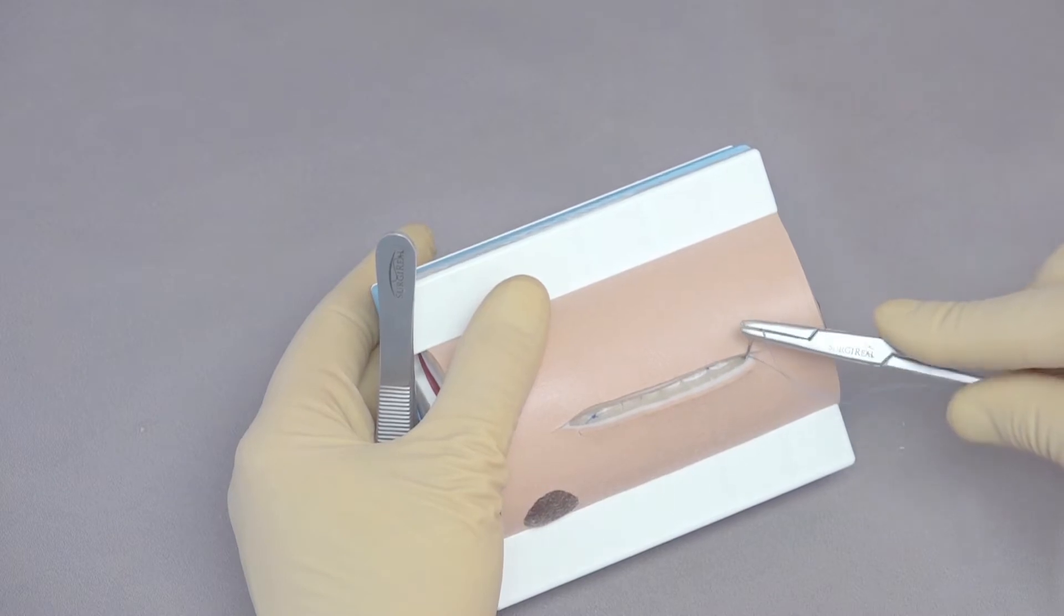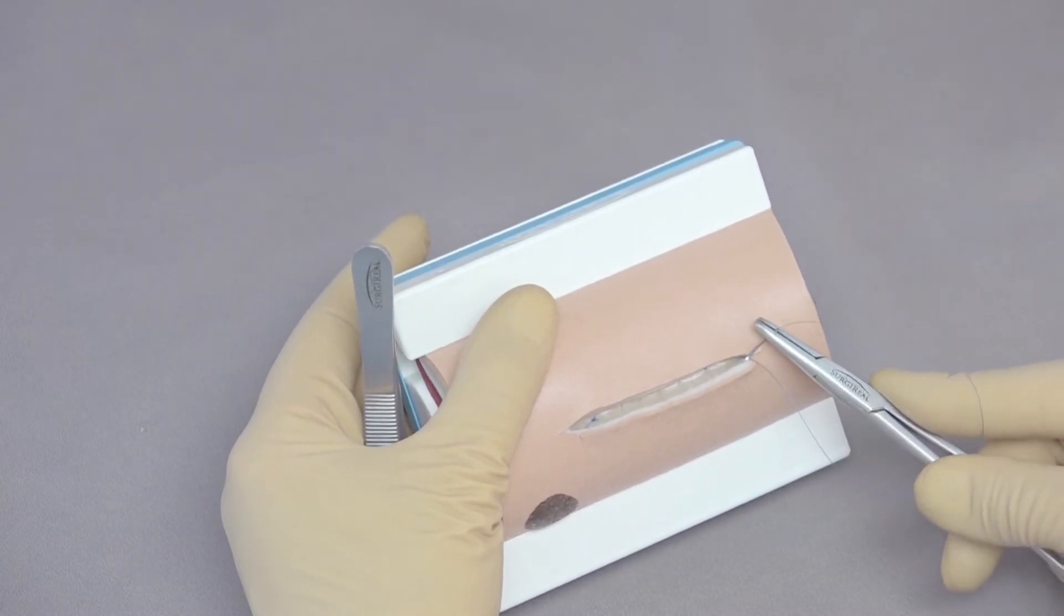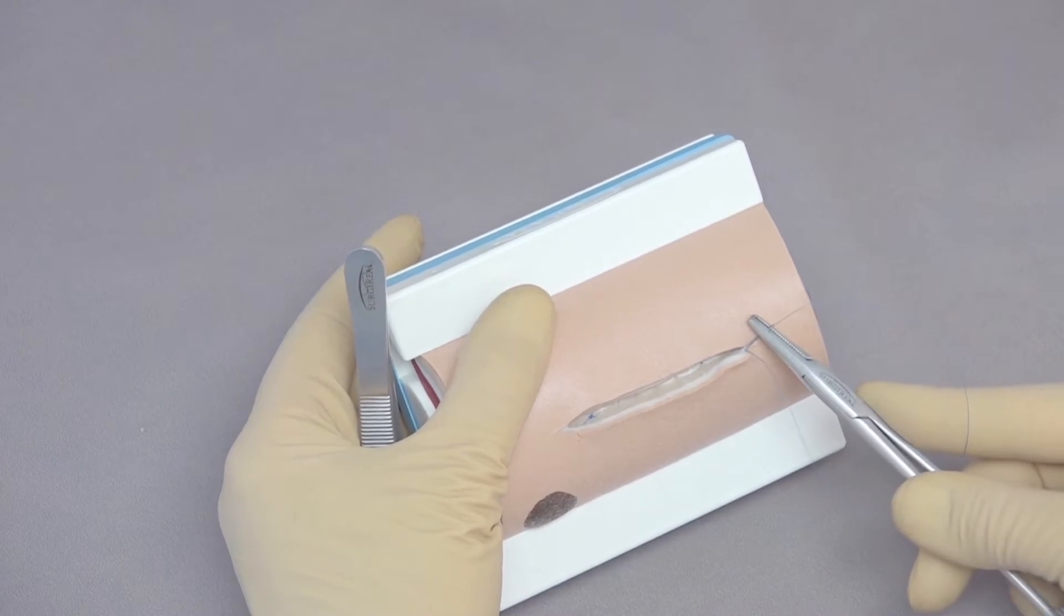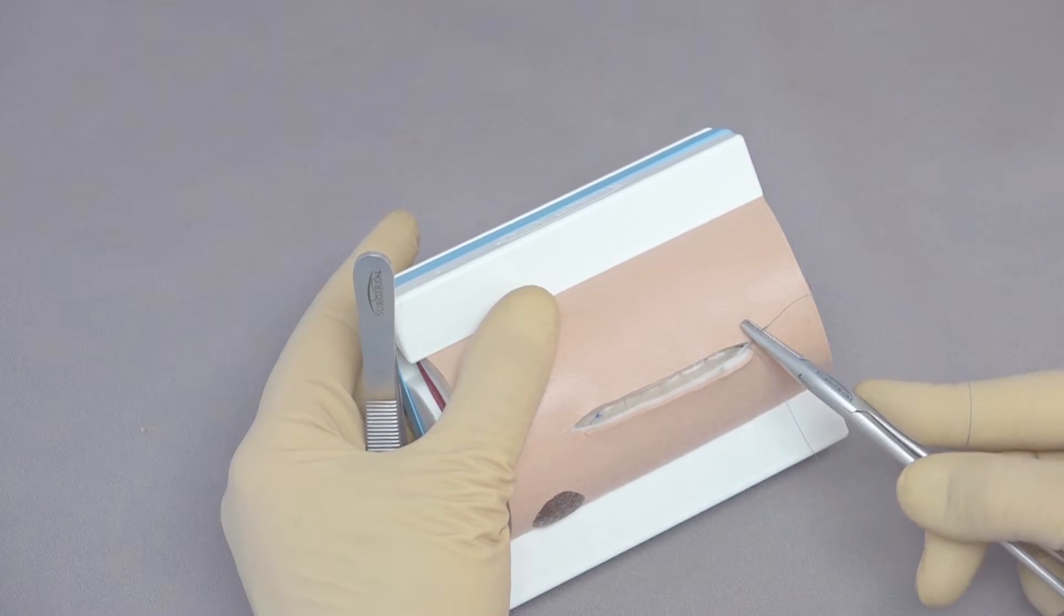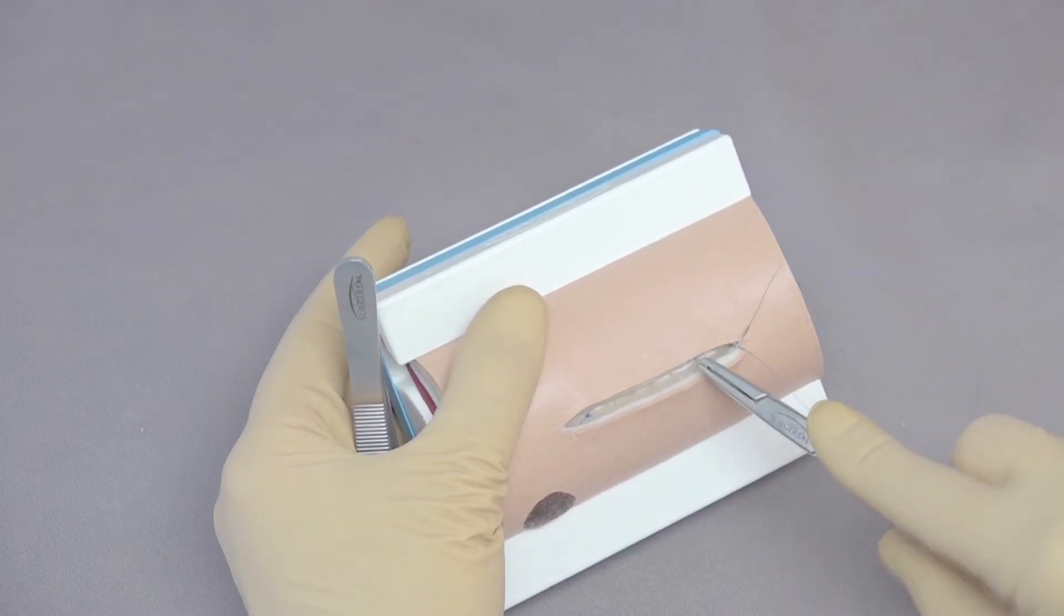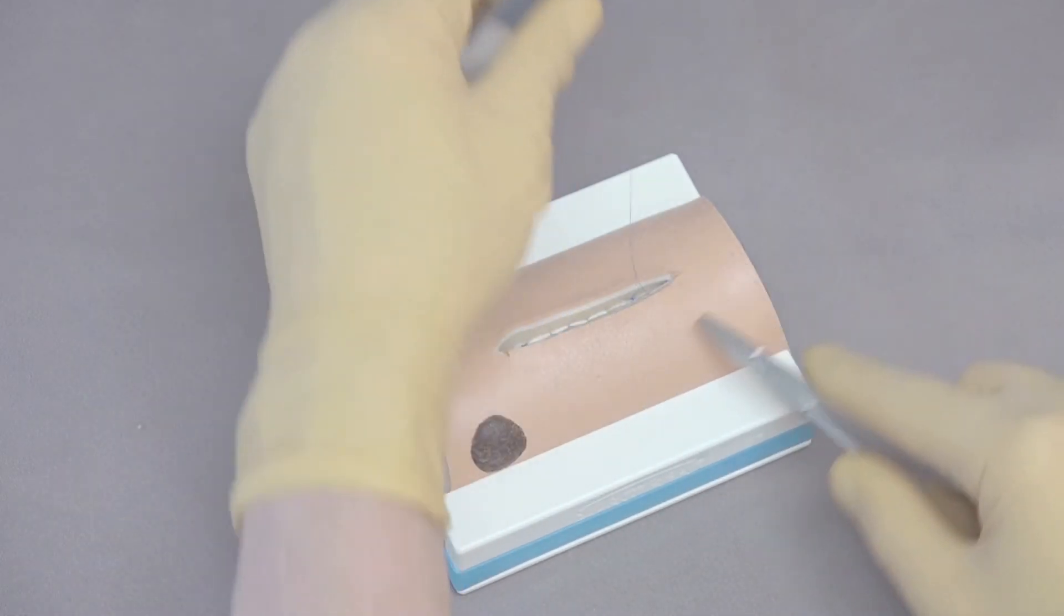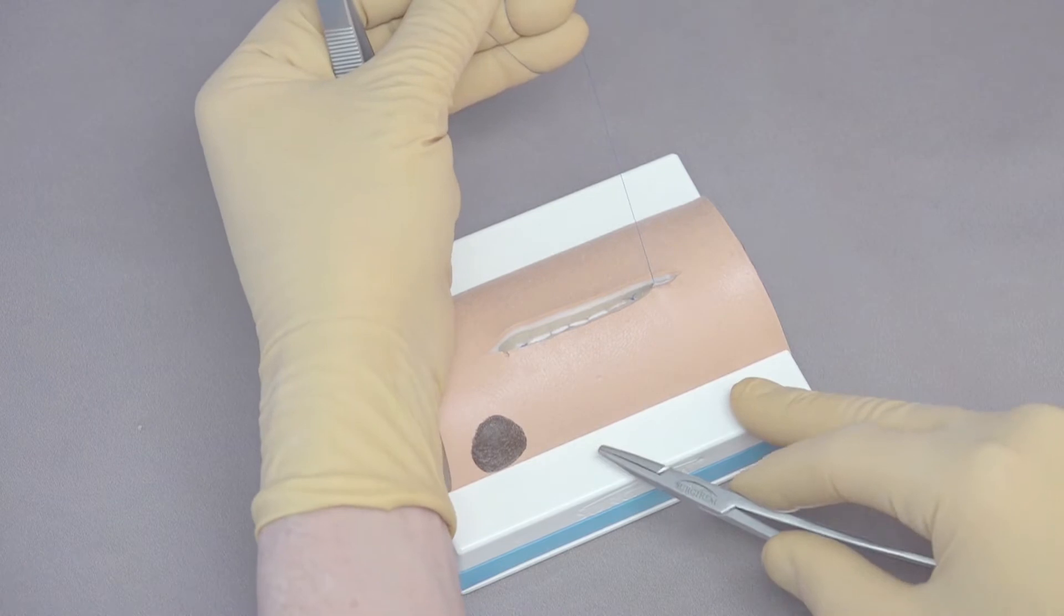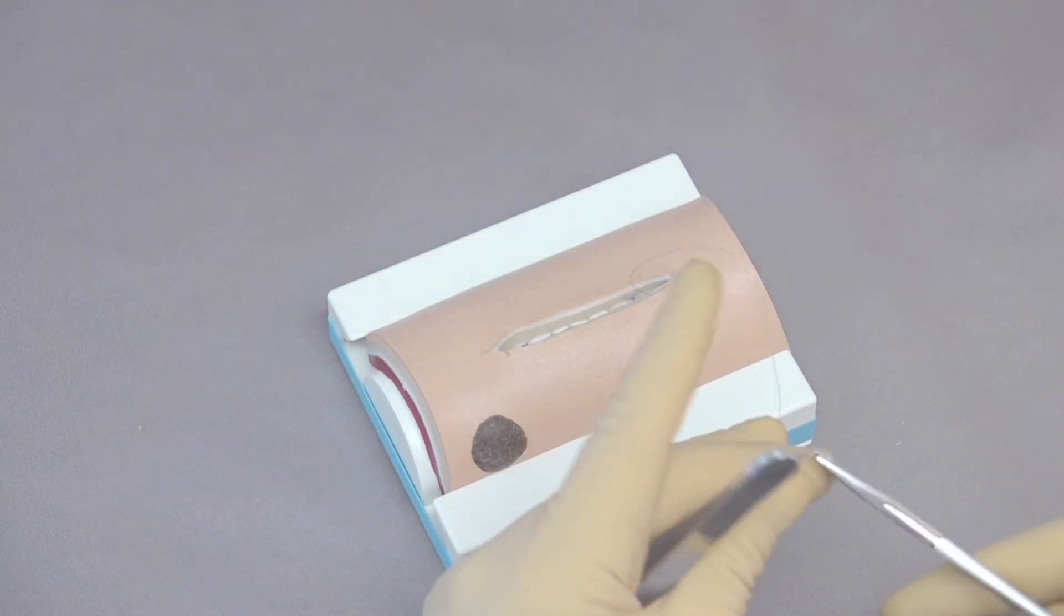So we're going to stay on the near side. We're going to work our way from the deep area and stay just underneath or at the junction here of the dermis and epidermis. And you want to make sure that you take your time to make that bite just right where you want it to be. So we pull that through, see the knot stays buried. Now the important thing is to come across the incision straight across to do the rest of your suture bites.